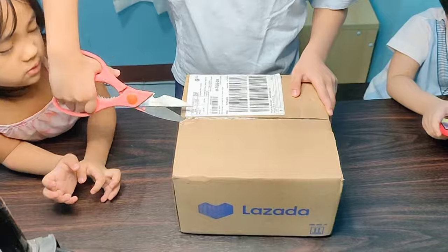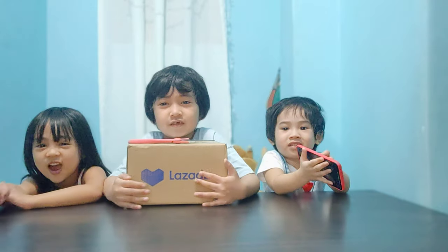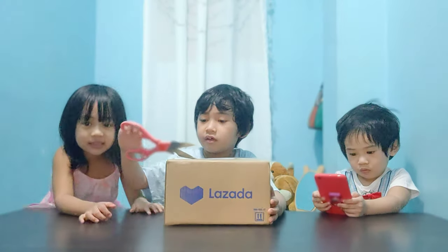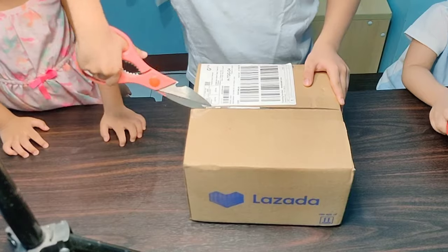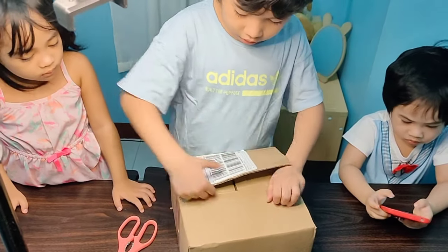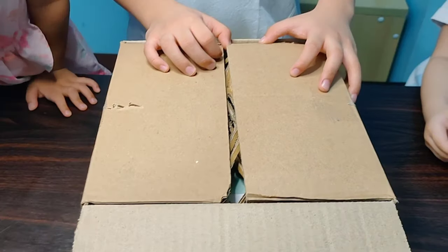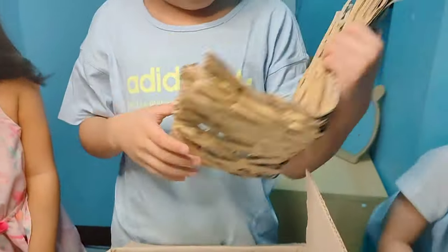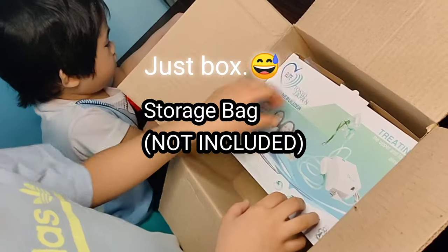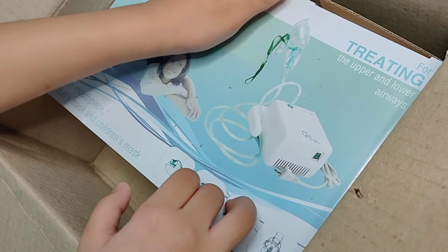Hello everyone, so we're going to end up in the box. Let's start! Here it is! This is a nebulizer for treating the upper and lower airways.